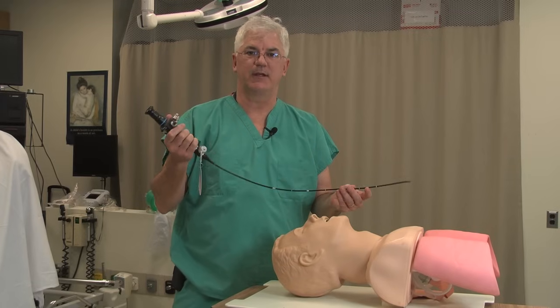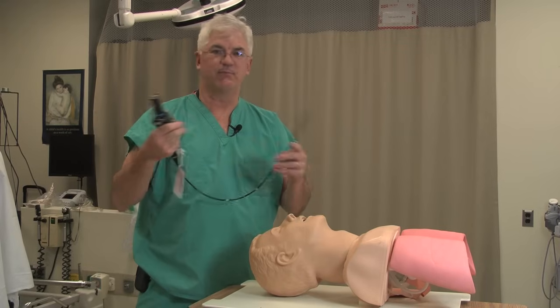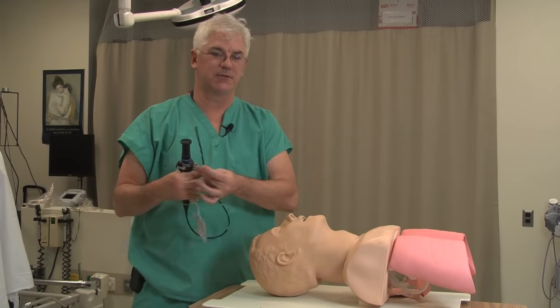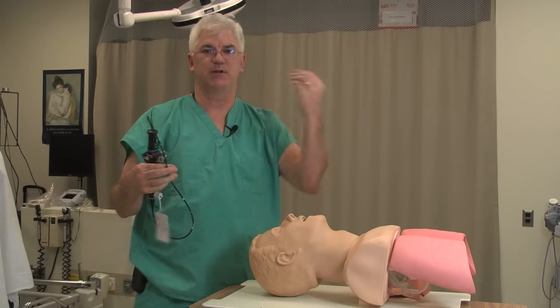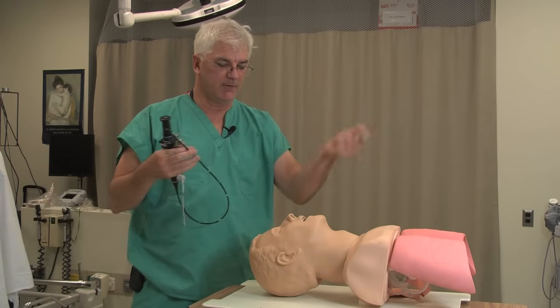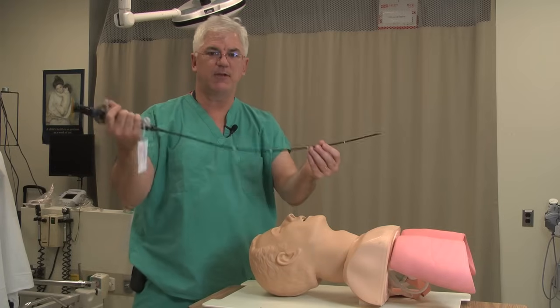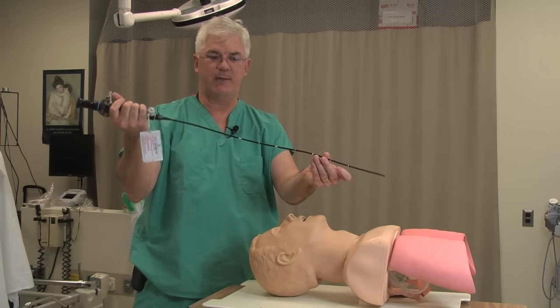I'm going to talk about fiber optic intubation. Modern medicine has gotten away from blindly doing things — we use ultrasound guidance to put in nerve blocks, to put in central lines. Likewise, when it comes to intubating, the notion of passing things blind has sort of fallen out of favor. So I'm going to talk about using the fiber optic.